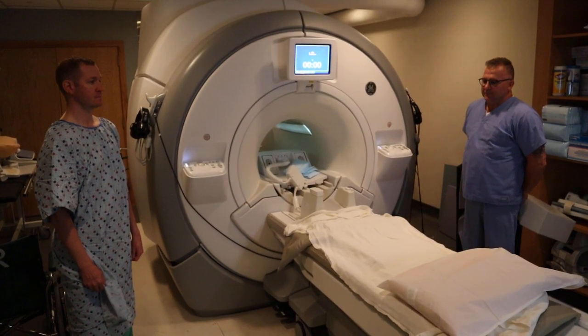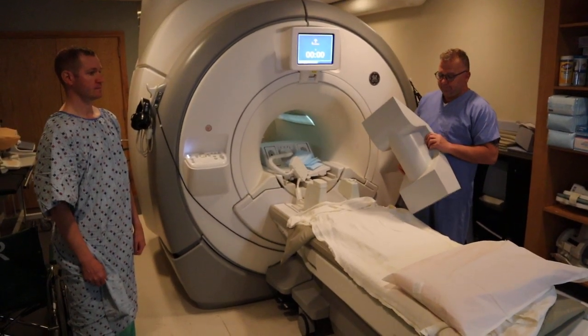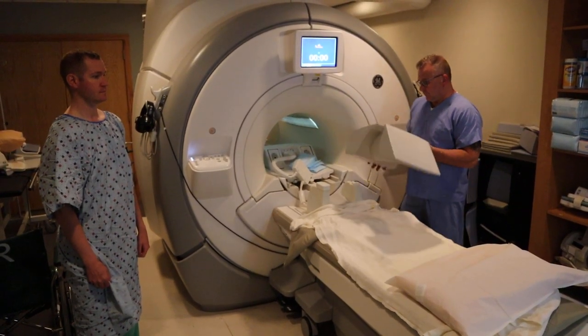We're now going to position for a lumbar spine feet first. This method would be for patients with large body habitus or are claustrophobic.